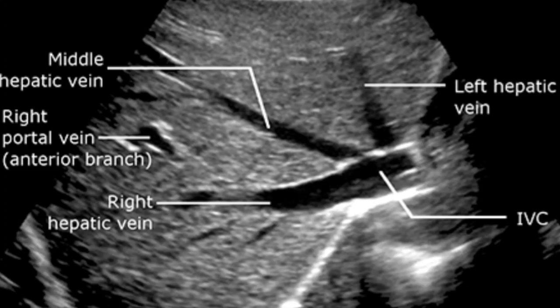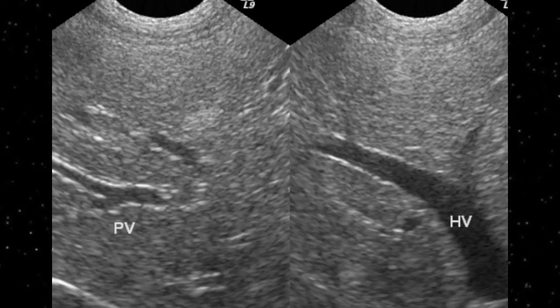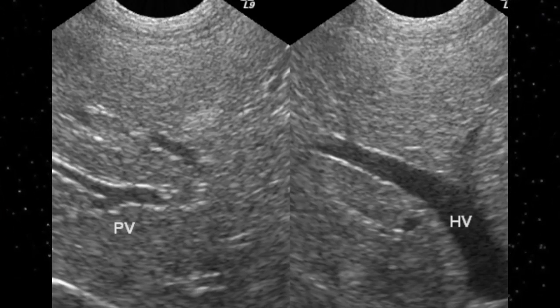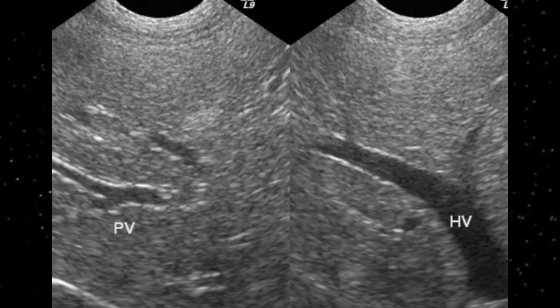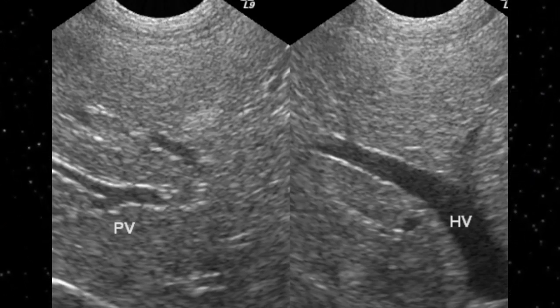So far as its size is concerned, 15.5 is considered to be a normal size. Any increase more than 15.5 centimeters would be considered as hepatomegaly. These are all the portal veins. You can appreciate the echogenic layer on the portal vein. Echogenicity is normally homogeneous and it has a smooth border, smooth outline. As compared to the right kidney, it appears hyperechoic, while as compared to the spleen, it appears slightly hypoechoic, and liver has smooth margin. There is no irregularity on the ultrasound.